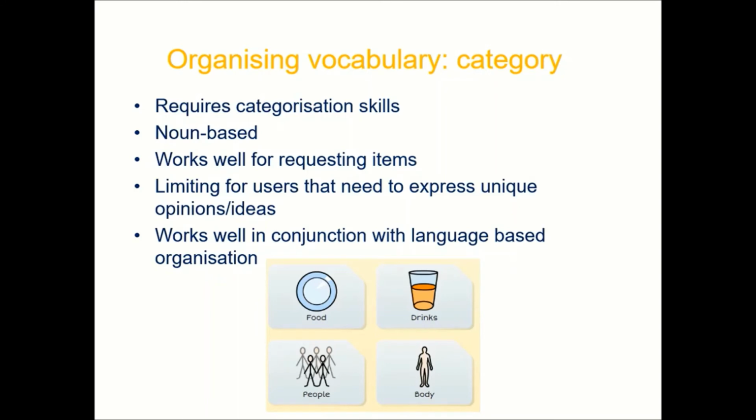And you can combine different organizations together. You might go into the food folder, and then again, you might have some sentence starters for I want, I like, I don't like, do you like. So you can still have some language there, but again, it's pretty limiting.